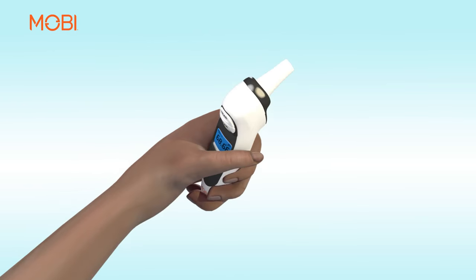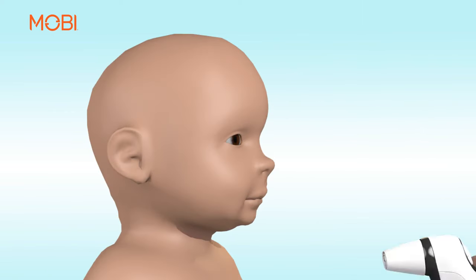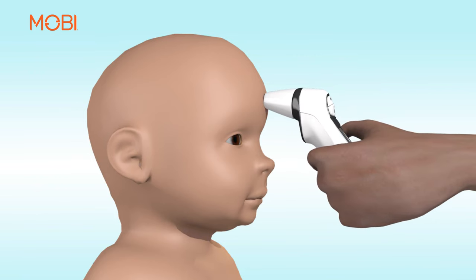To measure temperature via forehead, ensure the forehead probe cover is attached. Gently touch the entire tip of the probe to the center of the forehead, midway between the eyebrows and the hairline.